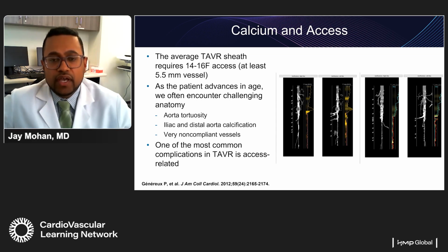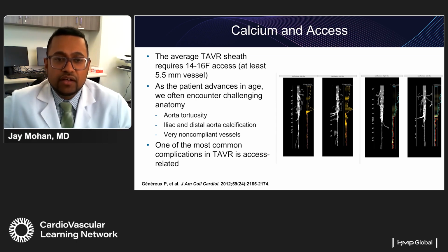Another issue is when the artery is extremely calcified and tortuous: is that sheath going to adequately be able to traverse that segment safely? When you're pushing against a rock, it's much harder to get anything up. But if you change the compliance and make the artery more soft and pliable, it's much easier to get that sheath up. And I'll explain that in a second.